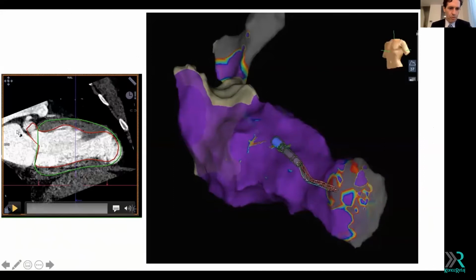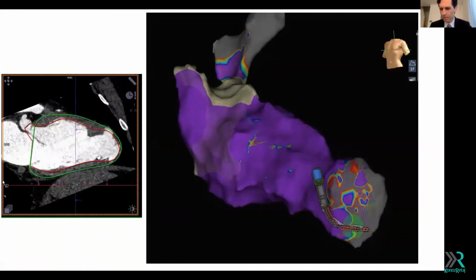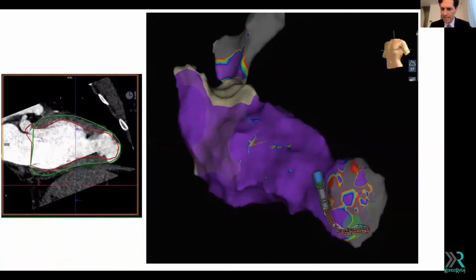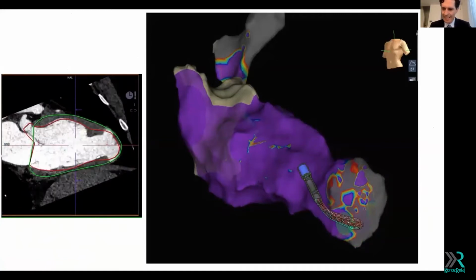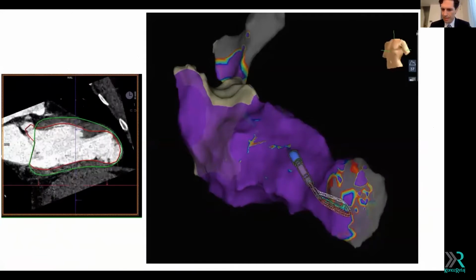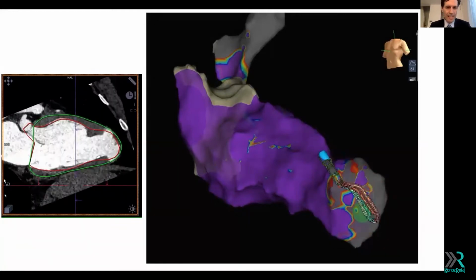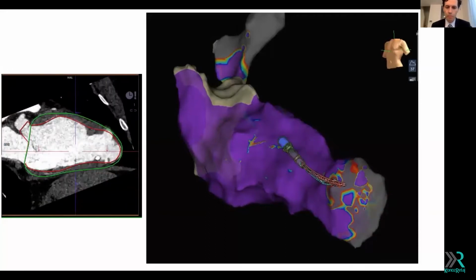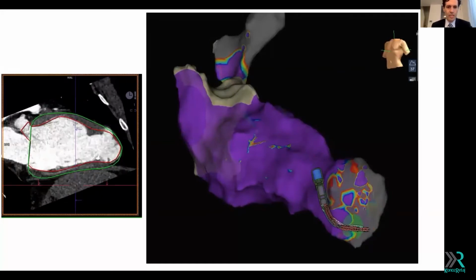You can push your catheter to map this structure because it's very important to identify the substrate and also the electrograms. And you can see that at the apex of the left ventricle, where we are there with a high density grid, there are no electrograms. And even the wall is not very thick, as you can see. It's only a few millimeters, but you can define easily and push without any problem. You will not perforate, and that is an important point, safety of this tool.